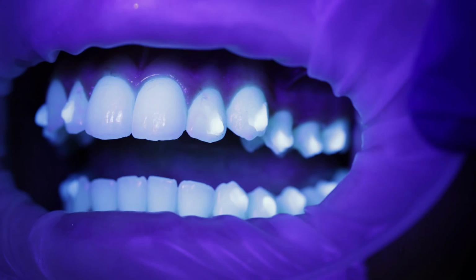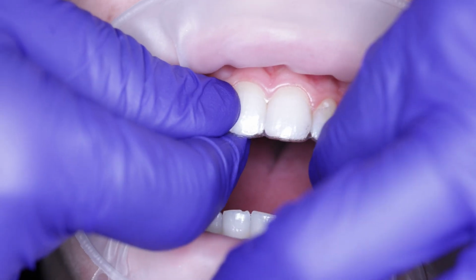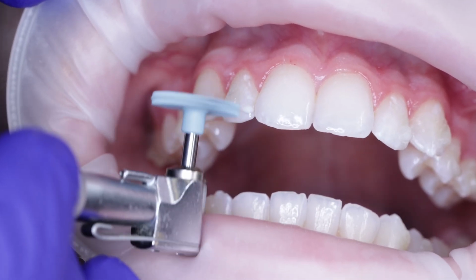But what I'm doing is I'm taking the polisher and I'm just removing the excess flash, the excess adhesive. It's super easy to do. And yes, I do cheat a little bit because I want to go around and make sure that, again, I don't have a whole lot of excess flash. Now, I'm going to back up just a little bit because it went too fast. We're going to remove, again, the attachment template.